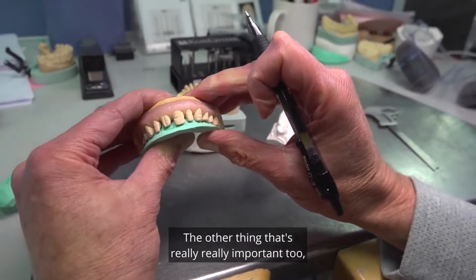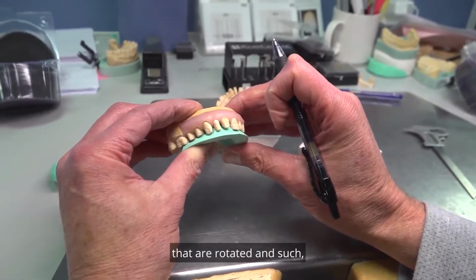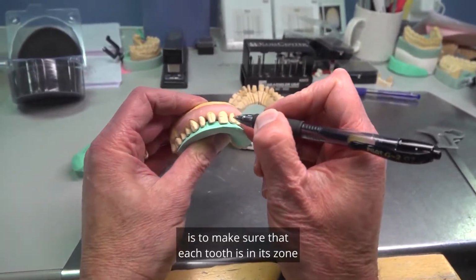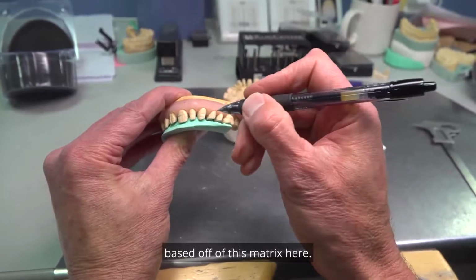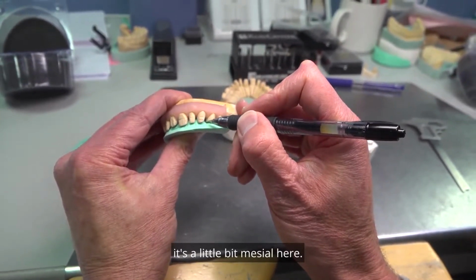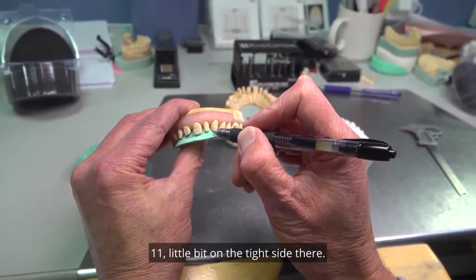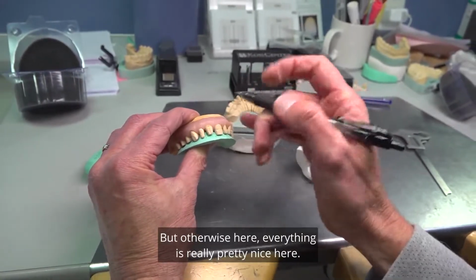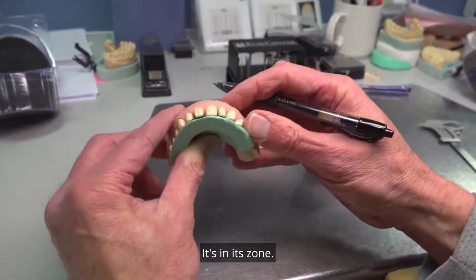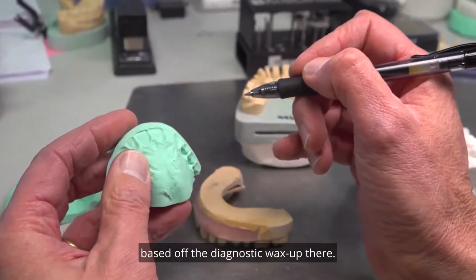The other thing that's really important too, especially if you have cases that have teeth that are rotated and such, is to make sure that each tooth is in its zone based off of this matrix. As you can see here, as you get to number 12, it's a little bit mesial. 11, a little bit on the tight side, but otherwise everything is really pretty nice. So everything lines up, it's in its zone, and you can just think of the zones as the zones of the teeth based off the diagnostic wax up.